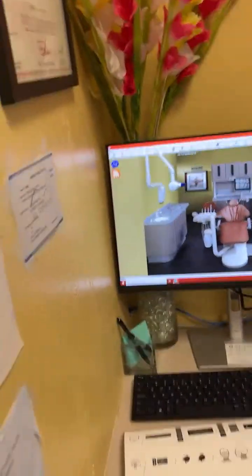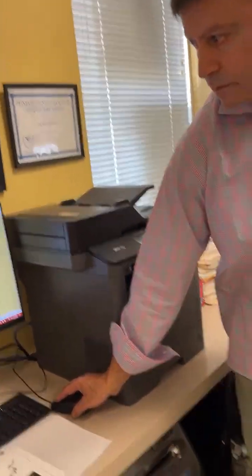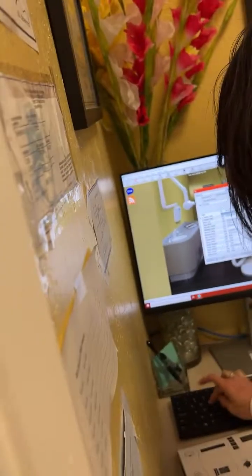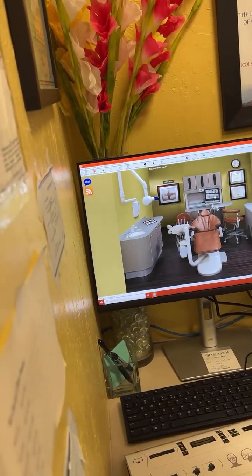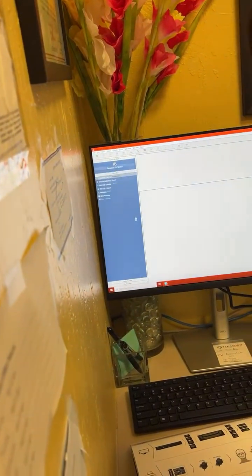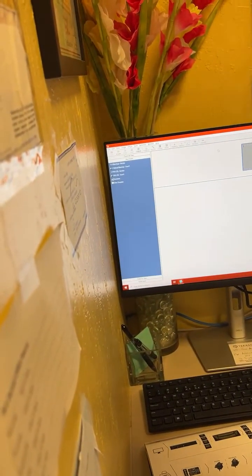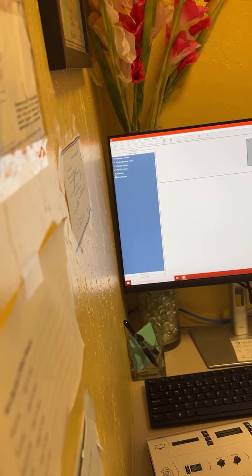There you go. Select your patient in the chair. Oh, one of you guys can do it so you can feel it. You don't have to take it. Let one of them do it so they can just use it. It's the same as what you've always been doing. Exam, panoramic, and acquire. Same thing. Now it launches the drivers.